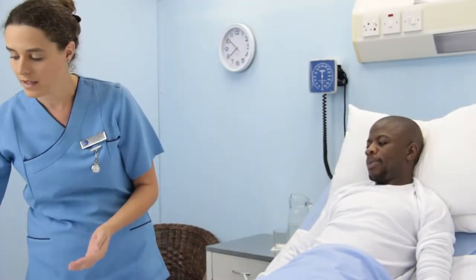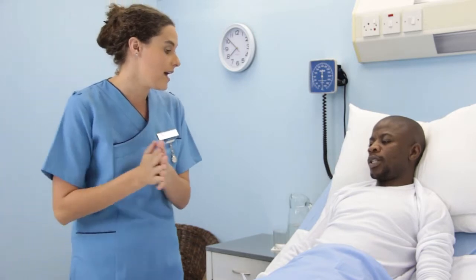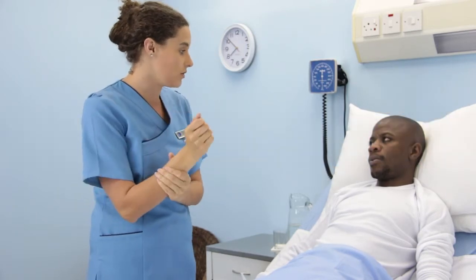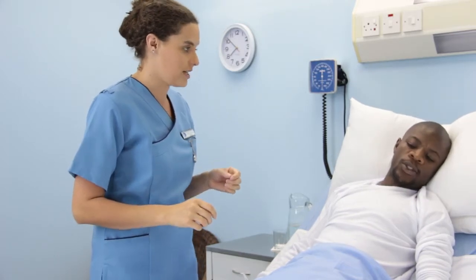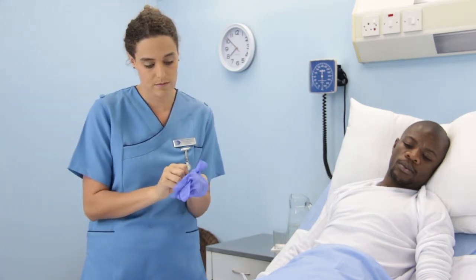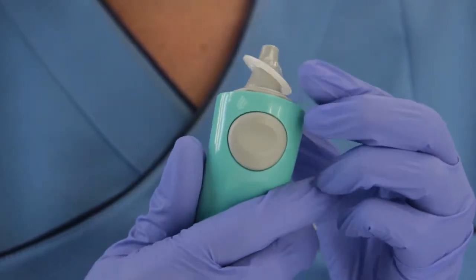Implementation. Perform social hand hygiene. Provide privacy for the patient if required. Confirm the patient's ability to assist you with the procedure. Put on gloves if expected to touch bodily fluids. Cover the thermometer with a protective cover if required.